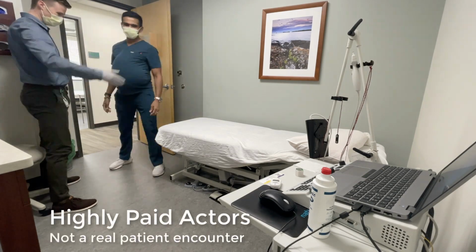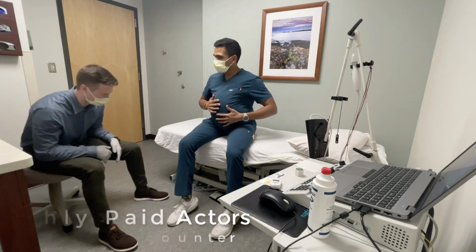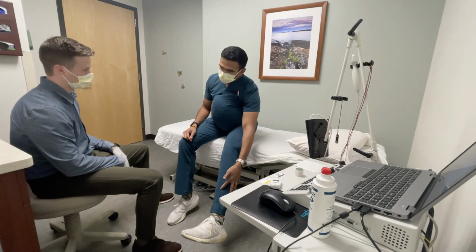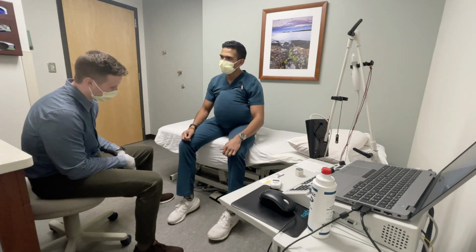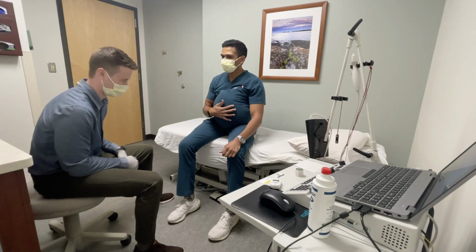This is a relatively healthy 28-year-old obese male with a history of hypertension who presented for a left lower extremity EMG. The patient works as a laborer and reports that over the past month he has had numbness and tingling over the lateral aspect of the left lower extremity, particularly over the left lower leg. He reports that this pain is most bothersome at night and denies any weakness in the left lower extremity.